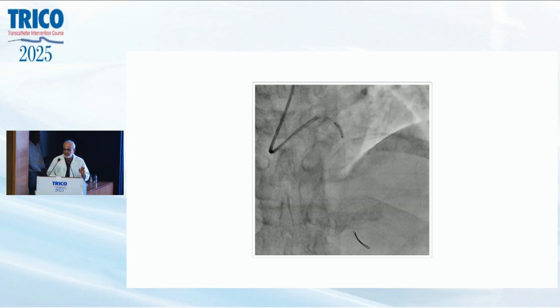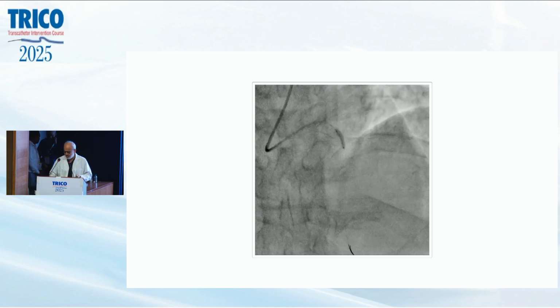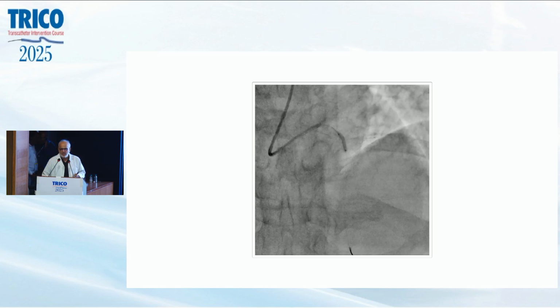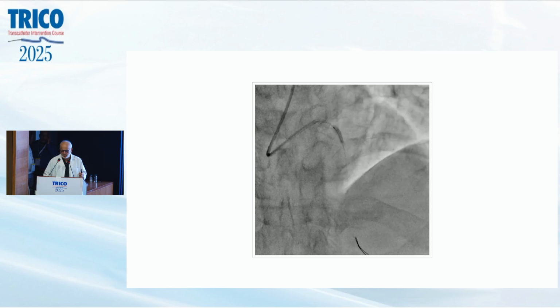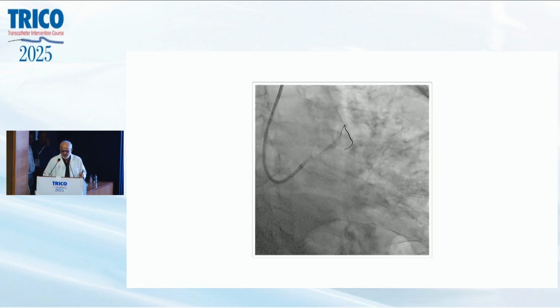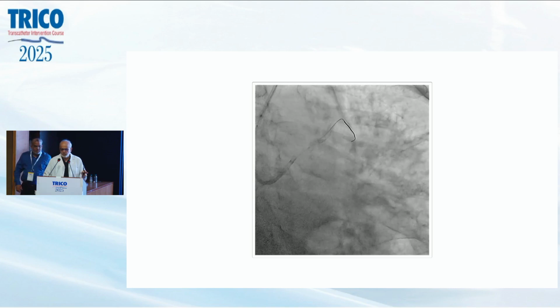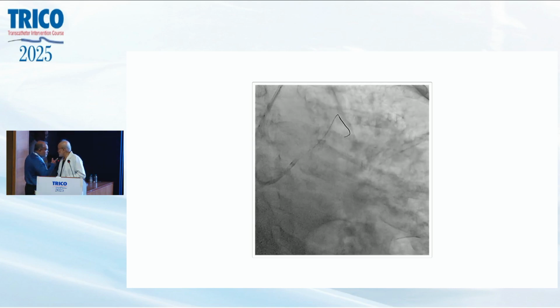It will create tamponade and an emergency. So instead of an MSA of 6 or so, I kept myself happy with an MSA of around 5.2.